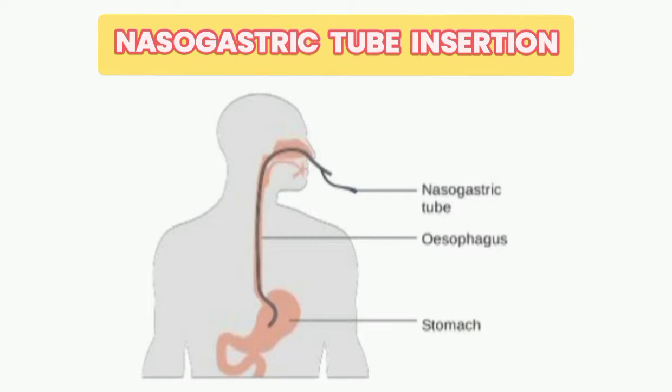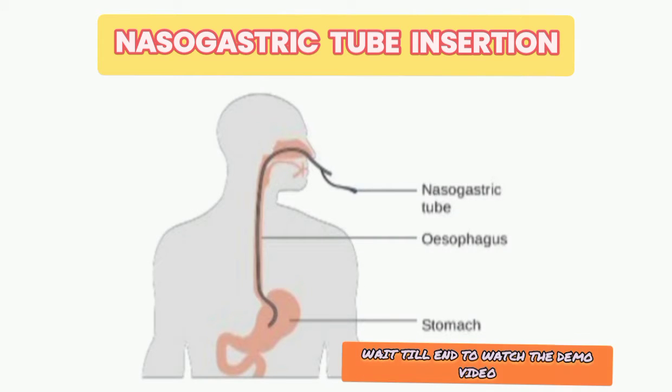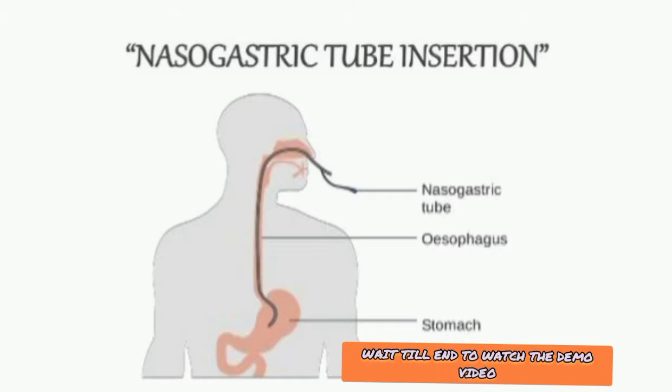Today I'm here with you all to discuss one important procedure, that is nasogastric tube insertion. So without wasting much time, let us start with the topic. At last, after the discussion, I will also show the procedure with the help of a video.